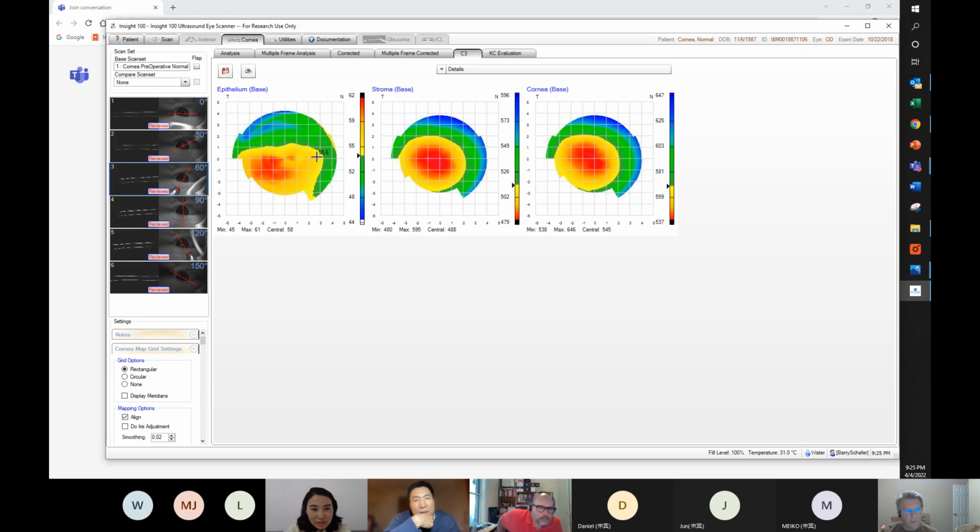Okay? And so it could be you only took a few scans. If you look on the lower left down here, it says display meridians. Can you see that? And then I click that box. There's each of the meridians I took. For this patient, all those meridians cross perfectly in the middle. They fixated well.